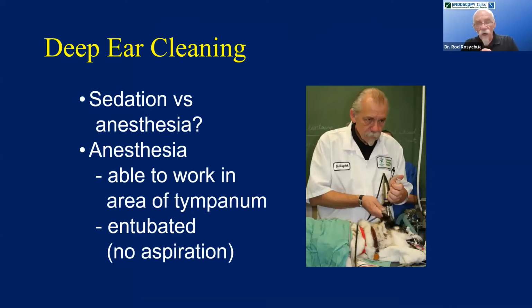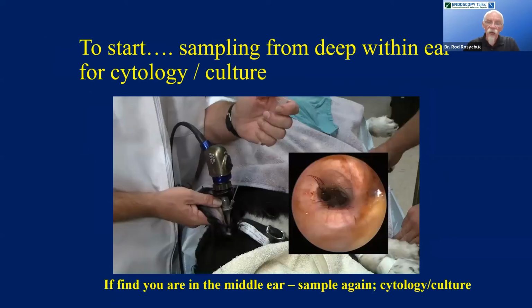Probably the thing that I do most, as far as frequency is concerned, is deep ear cleaning. This is ear cleaning not only of the canals but, not uncommonly in our service, because we see a lot of complicated ear issues, also middle ear cleaning. For these procedures routinely, we feel very strongly that we need general anesthesia. This is a very sensitive part of the body, and minimal stimulation in the area of the tympanum will get an individual shaking their head, and we can't tolerate that as we're working deeply in ears. Anesthesia also prevents the potential for aspiration if we happen to be flushing through a middle ear into the auditory tube and the posterior pharynx, so we won't encounter any complications related to that.